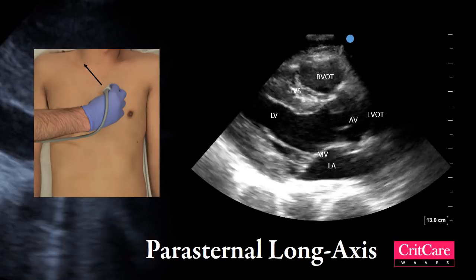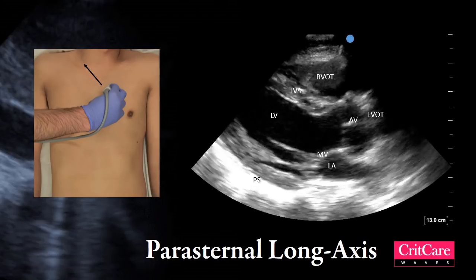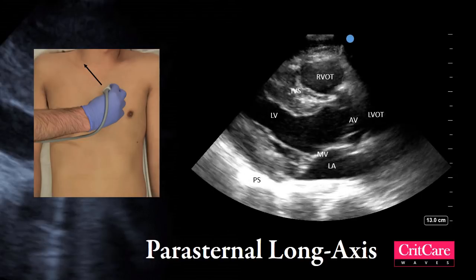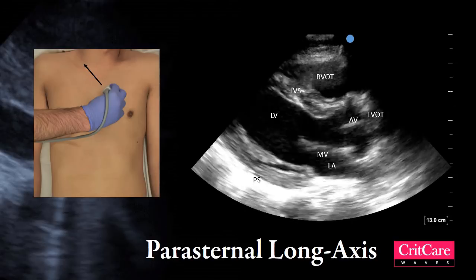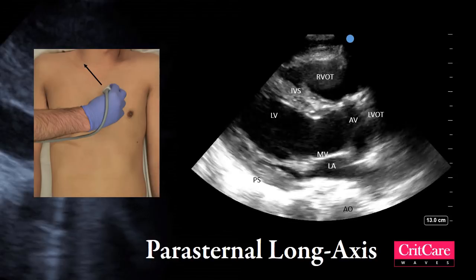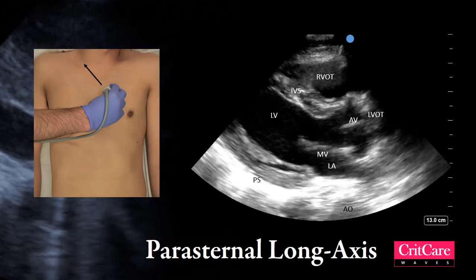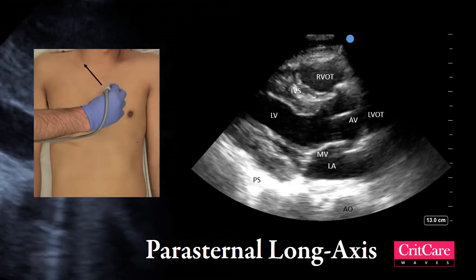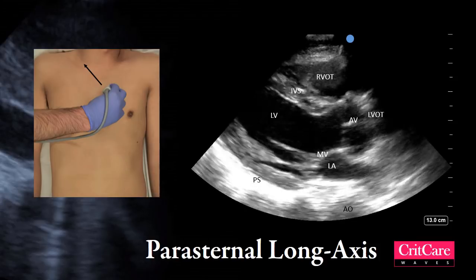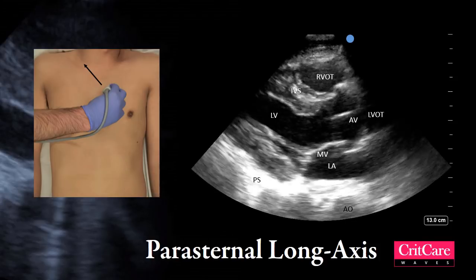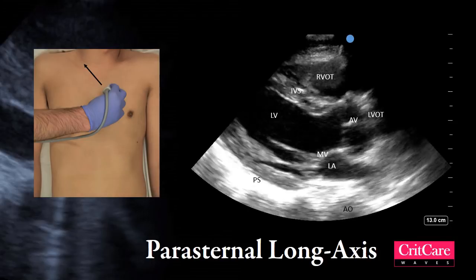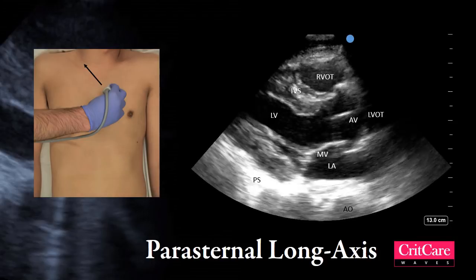The pericardial stripe is the hyperechoic shadow seen in the far field. The descending aorta can be seen in the far field near the left atrium. This is an important anatomic structure that differentiates pleural effusions from pericardial effusions. A good parasternal long axis image is obtained when all of these structures are visualized in the same plane.